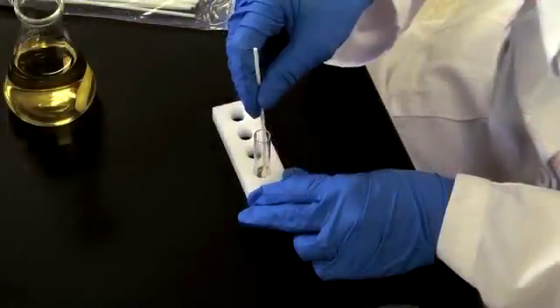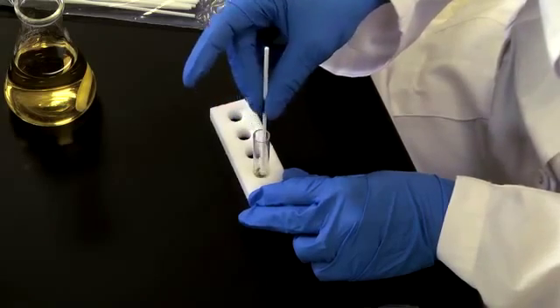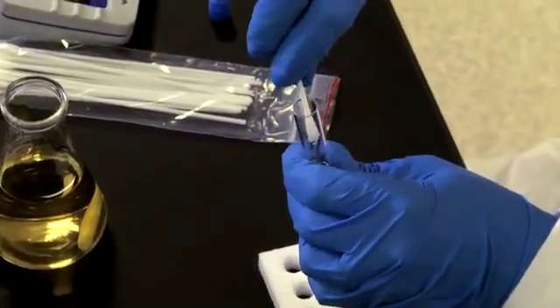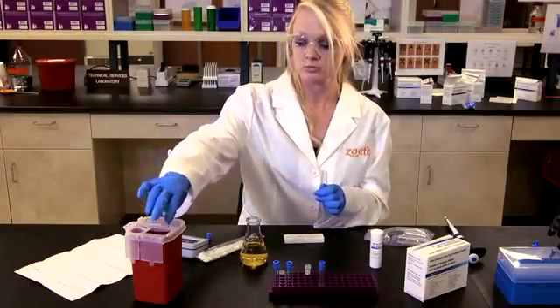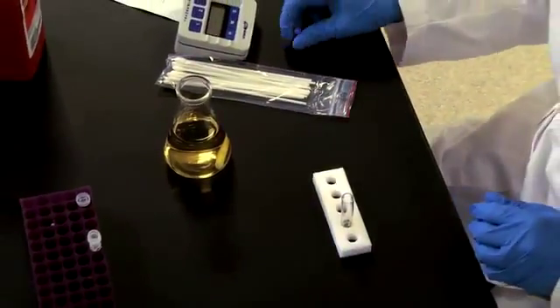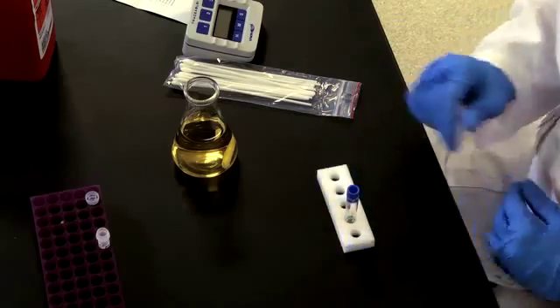Next, place the swab containing the specimen in the tube and rotate the swab 5 to 10 times in the broth. When removing the swab from the tube, press it against the side of the tube repeatedly until no more liquid comes out of the swab. Discard the swab in an appropriate biohazard container. If the extracted sample will not be tested immediately, cap the tube with one of the caps provided in your kit and store the sample.